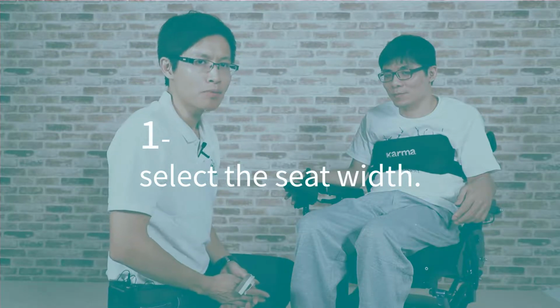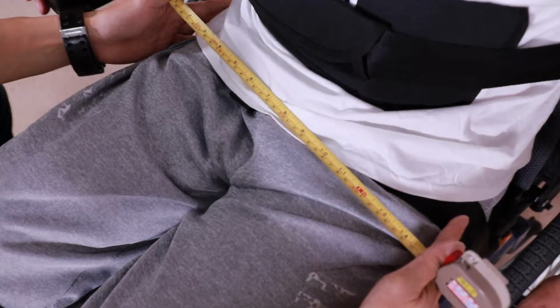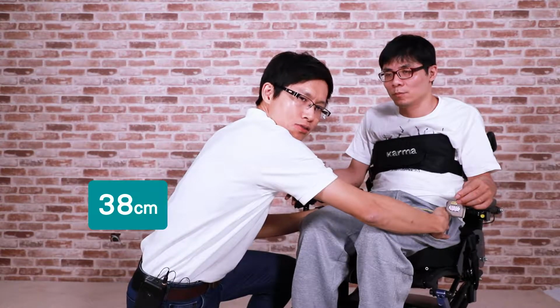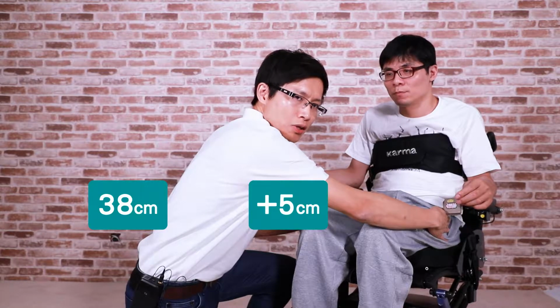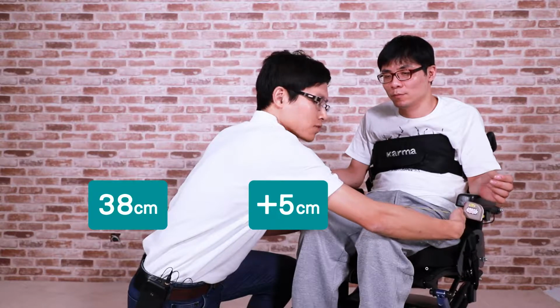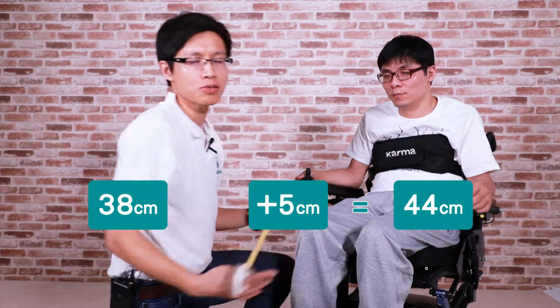To select a seat width, we must measure the widest part of the user's hip and thigh. Mr. Zhang's hip is the widest part of his base, which is 38 centimeters. Generally, we will add 5 more centimeters so the user can sit more comfortably. Therefore, Mr. Zhang is most suitable for the 44 cm seat width. Ergo Stand has seat width options of 40, 44, and 48 cm. Based on what I've measured, Mr. Zhang is most suitable for 44 cm.